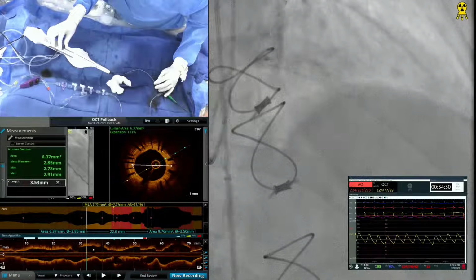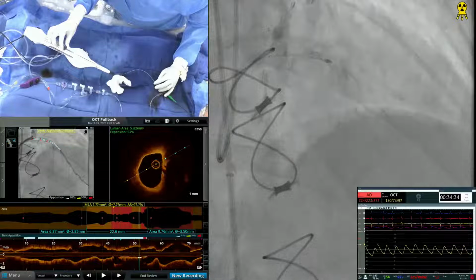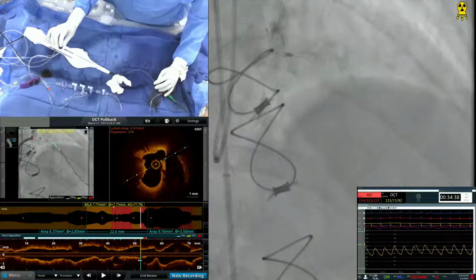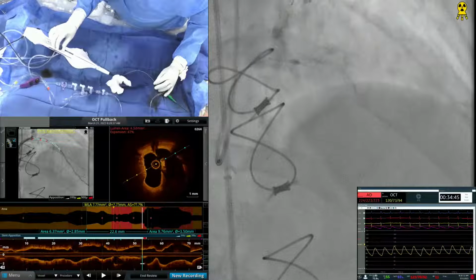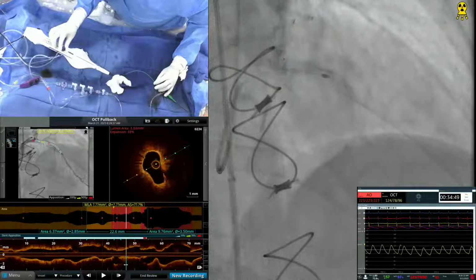You know what's happening is that part of the stent, right? That's why I said 175. The diameter was 1.5. So there's a chance of getting the bur stuck in more. So this is the 1.5 bur, which meticulously went through.